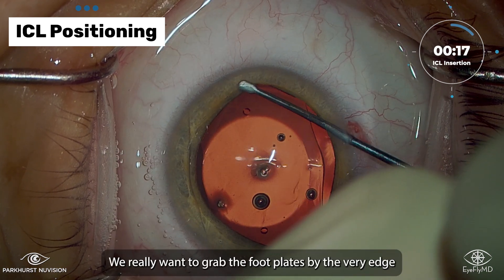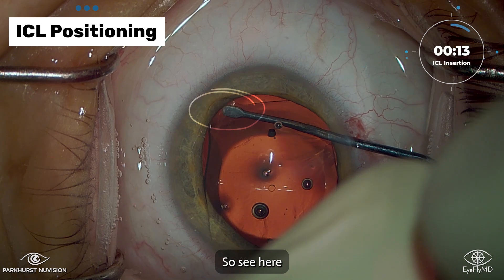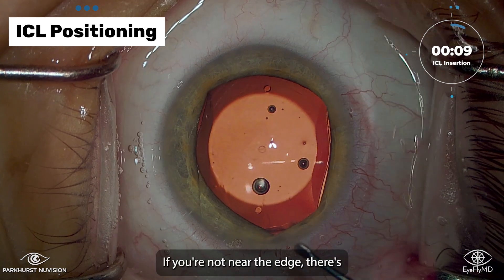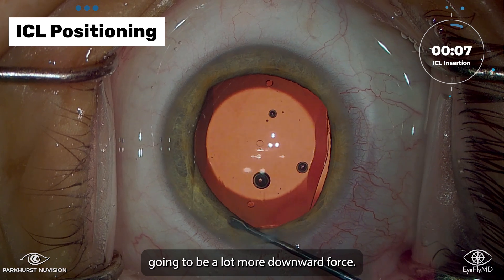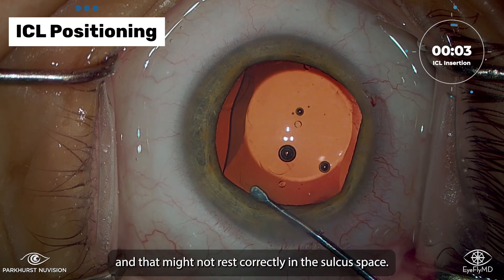We really want to grab the footplates by the very edge, or as close to the edge as we can. See here — we're reaching right towards the edge, working our way out there if possible. If you're not near the edge, there's going to be a lot more downward force. You might curl up the edge of the footplate, and that might not rest correctly in the sulcus space.